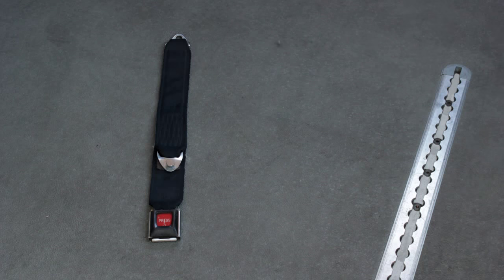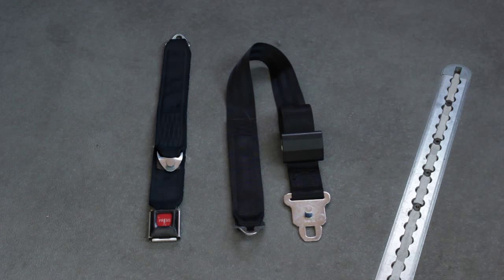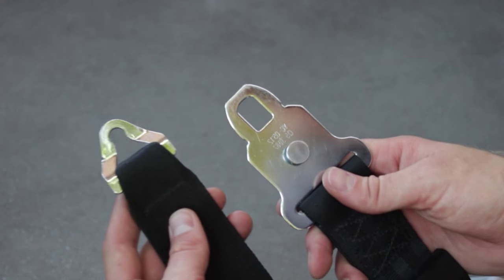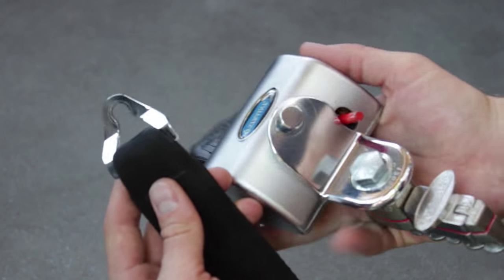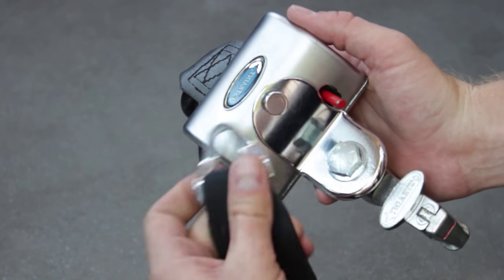Each set of tie-downs also has a seat belt for the wheelchair occupant. This end of each restraint will be attached to the tie-down. On each tie-down, you will find a metal knob that this end of the strap will attach to.